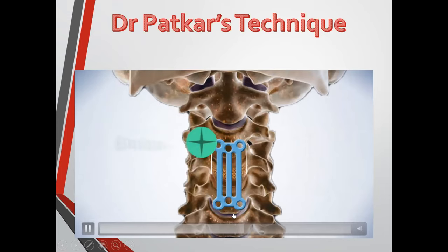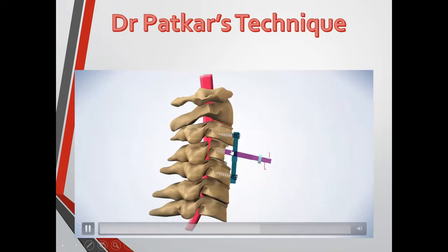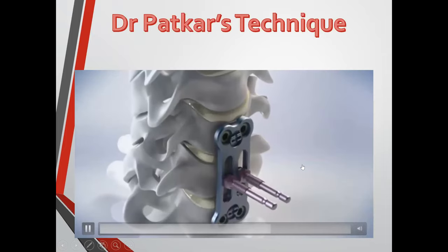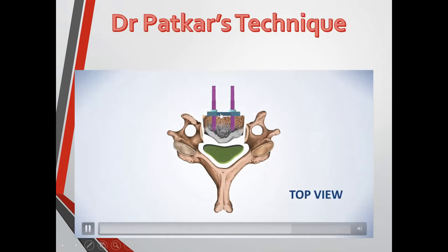This is specially made for me by Jeon Company. You can use any plate, but Jeon made the screws for me where you dial the screw, and as you put a nut, the vertebra is pulled up and you break off. So the vertebra with the OPLL is pulled anteriorly and the cord is decompressed as you tighten the nuts.